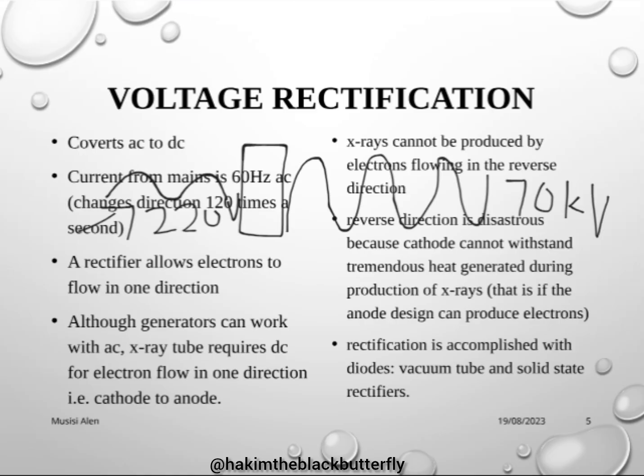The rectifiers, if you remember your electricity in physics, maybe in high school, are there to convert the alternating voltage to direct voltage, or alternating current to direct current.